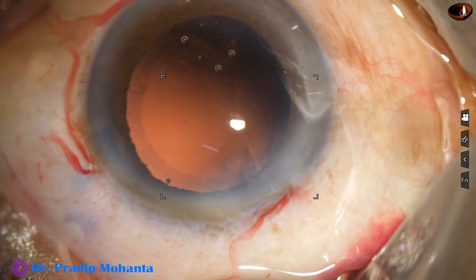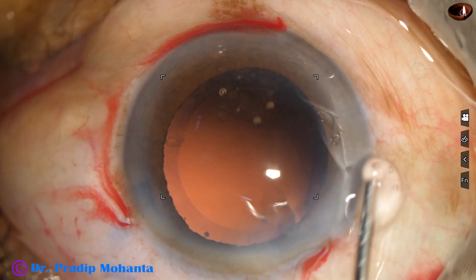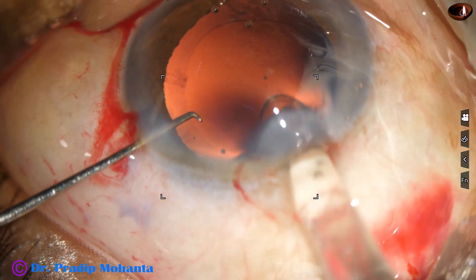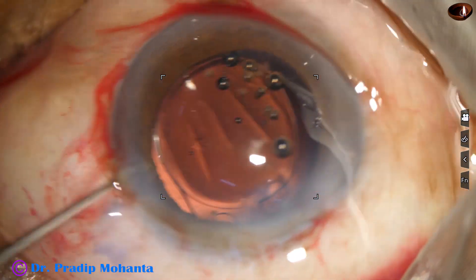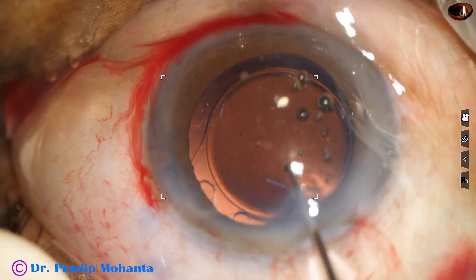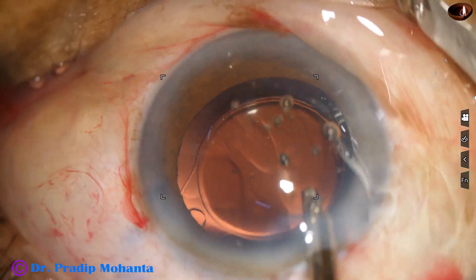Now I inject viscoelastic to fill up the capsular bag as well as the anterior chamber, and then implant a monofocal single-piece intraocular lens in the capsular bag. I dial the lens and place the haptics about 90 degrees away from the main wound, so that I can go behind the IOL and remove the visco which is filling up the capsular bag behind the intraocular lens.